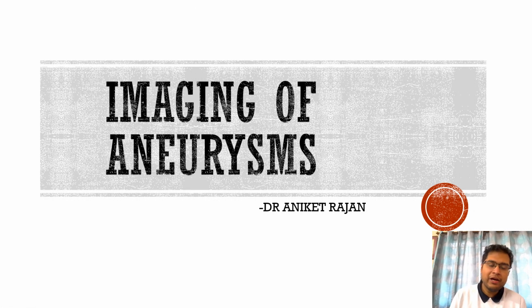So, hello everyone, and welcome to this important and interesting session of emergency radiology on imaging of aneurysms, where I'll be discussing a few important cases along with their reports. So, let's start with the first case.